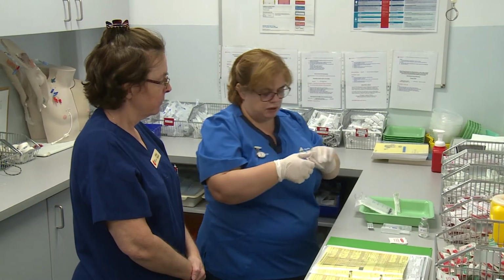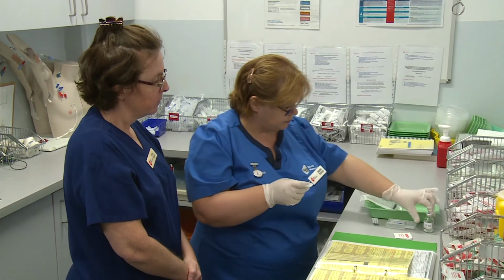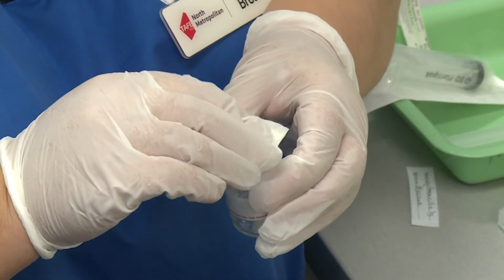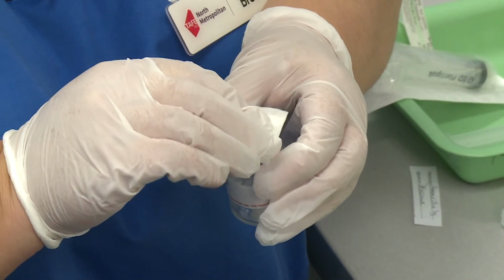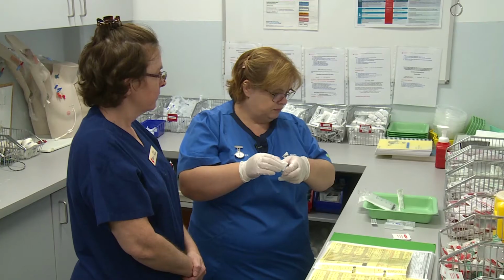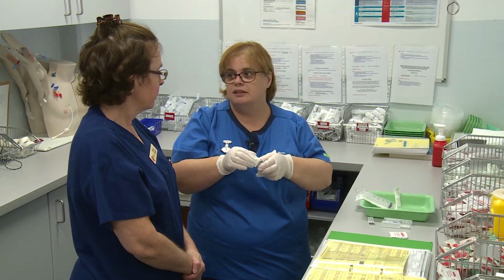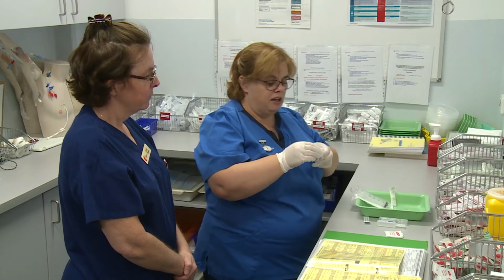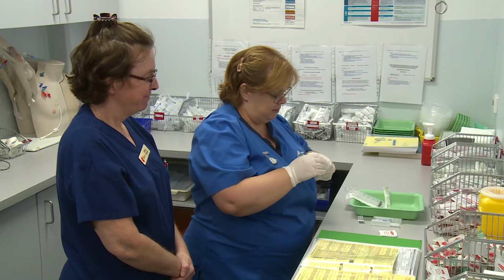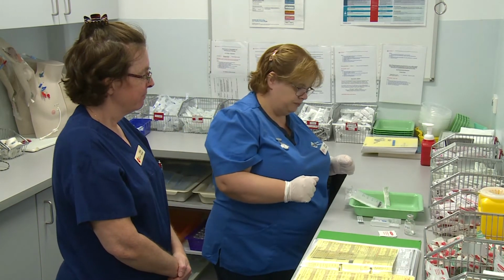So as mentioned before, I'm just going to use one of these to clean the top of my vial. Sometimes these vials will come with a metal cap on top as well. So even when I take the metal cap off, I have to clean it for 10 seconds. So when we're cleaning, what we're actually doing is decontaminating the area. Okay, so old habits die hard. I quite often say cleaning, but what I'm actually doing is decontaminating. Okay, I'm going to let that dry.